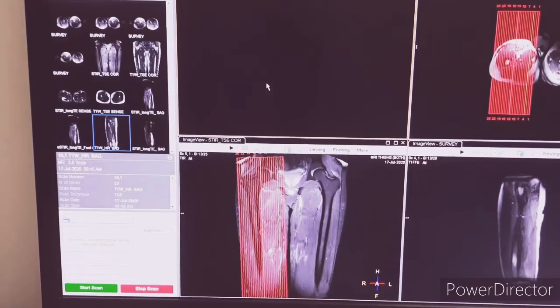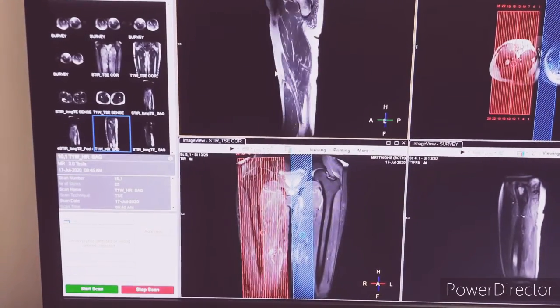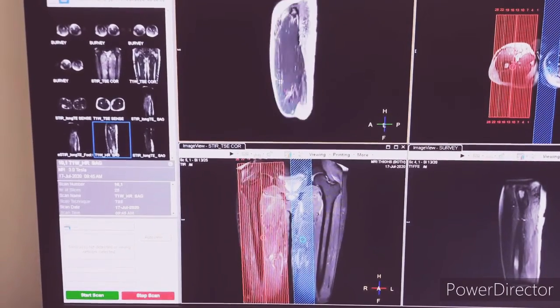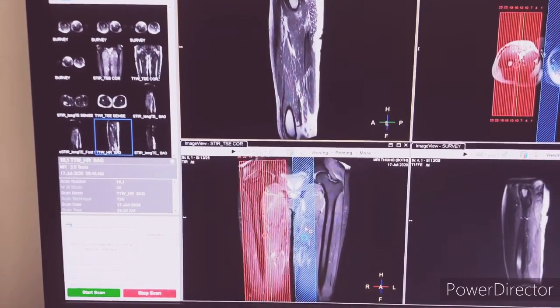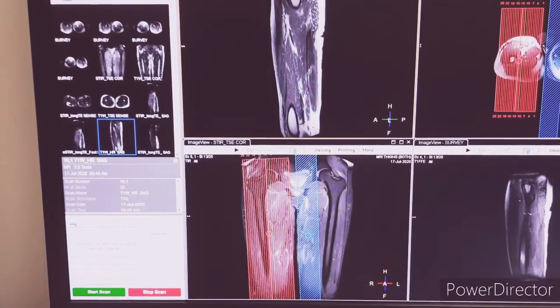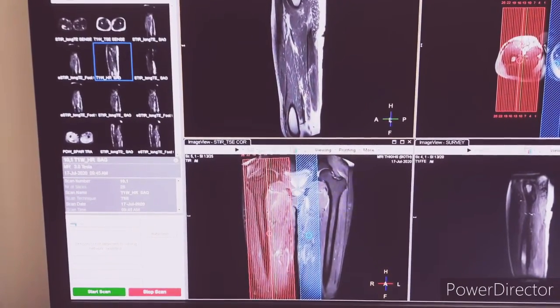Next is T1COR. Again, we have kept the planning the same as STIRCOR. You can see we have used a SAT band also, to avoid motion artifacts and flow artifacts.